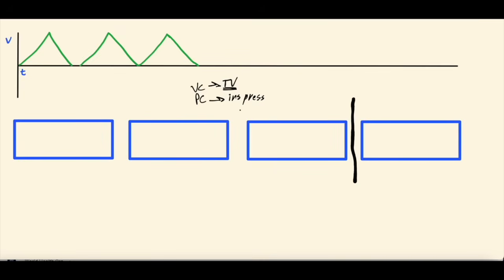That's the tidal volume. But what you're not controlling, the uncontrolled variable that results from this, is the pressure, the inspiratory pressure, the peak pressure in this case. In pressure control, you're controlling the pressure. You're saying, hey, ventilator, with each breath, I want you to give a set pressure. What is uncontrolled, though, is then the tidal volume, and we'll put uncontrolled for these, because that's the uncontrolled variable that results from the pressure you set.